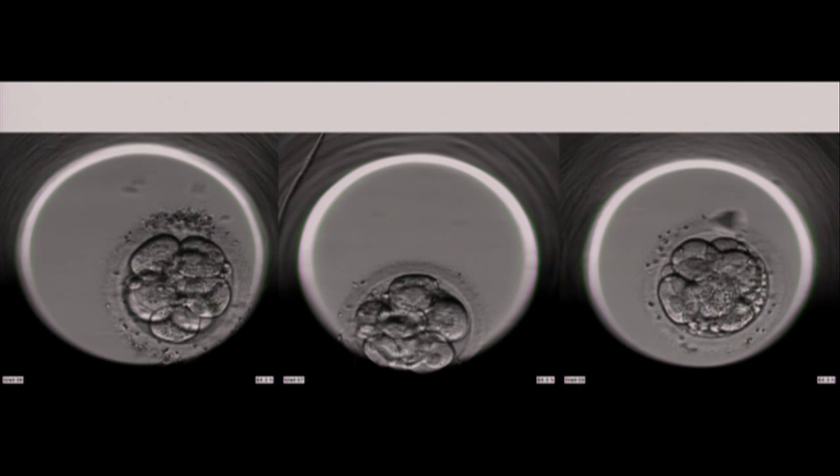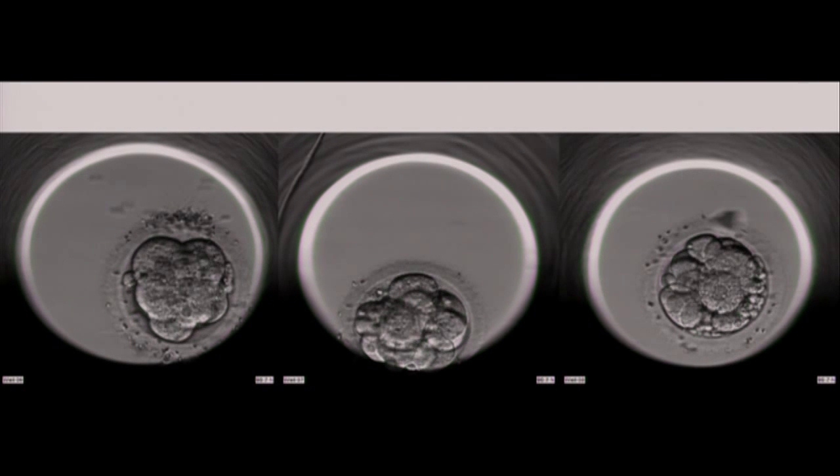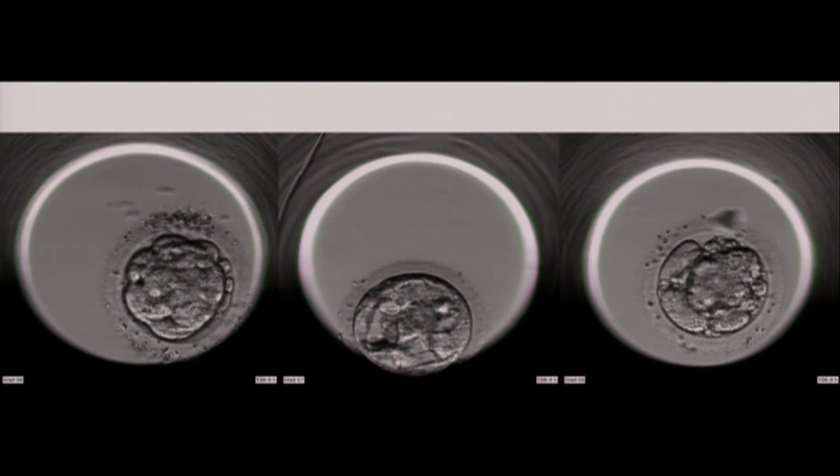And you'll see that some of these embryos actually have a different history, or they finally have a different fate. So you will see that they start growing very similarly, but then as we go along, they actually change in the way they're developing. So the one on the far right actually starts growing much more poorly, so it's not growing that well. Whereas the one on the left and the one in the center are showing better features of development. So the one in the center on day 5 becomes a really nice blastocyst, and you'll see it disappear in a minute because we transferred it back to a patient and she got pregnant, luckily. And the one on the left becomes a nice blastocyst a bit later than the one in the center, and we froze it later on.